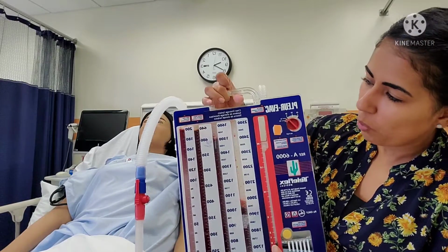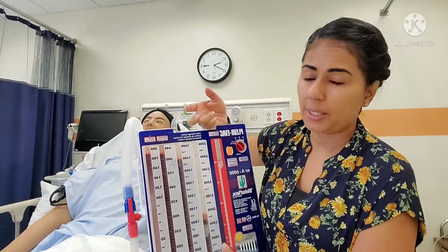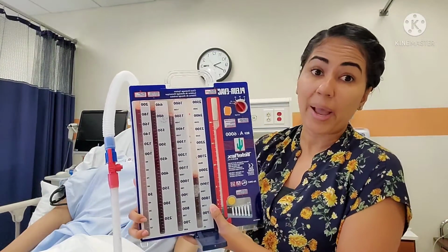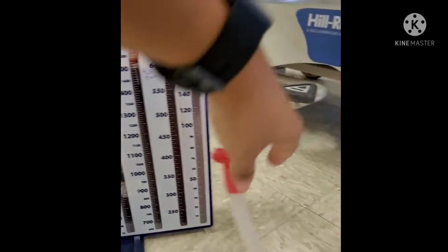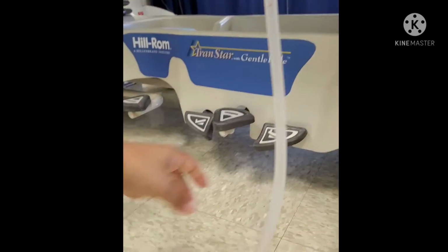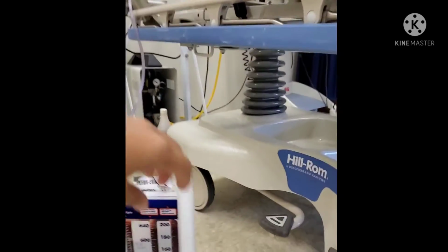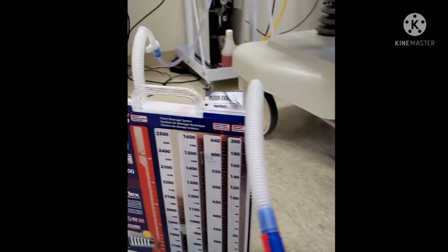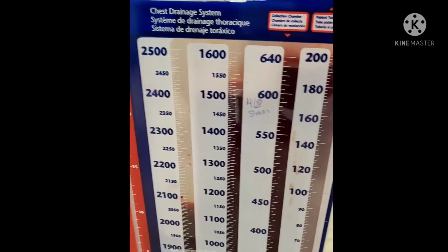Now, while we're here, let's look at our drainage system. We just drained some more blood into the drainage system. So let's look to see where it went. If you look at the chest tube, this is the tube that's coming from the patient, okay? It's connected to the patient, and it's going right into here. We have this corrugated tubing to help prevent it from kinking, okay? And it's going right into this drainage chamber.